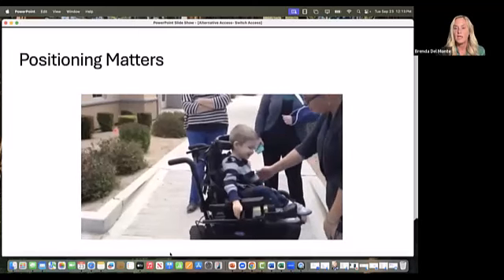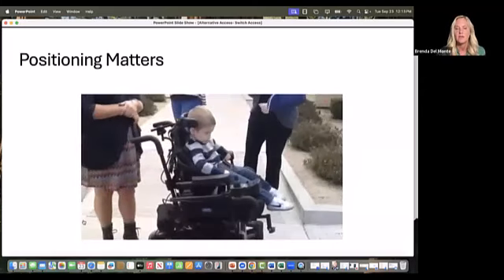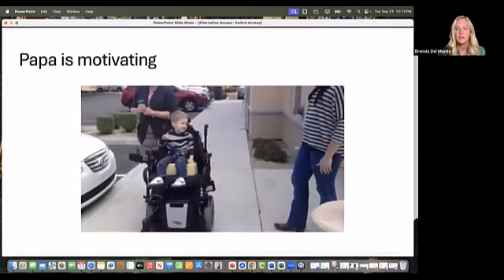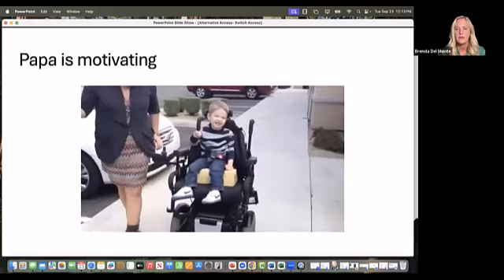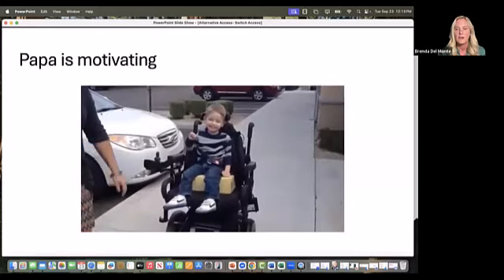So right away, she popped his bum under his shoulder and he is able to sit up straight. Where's he going? So here he goes. There's good. Come on, Cam. Yay! And go. Come on, buddy.